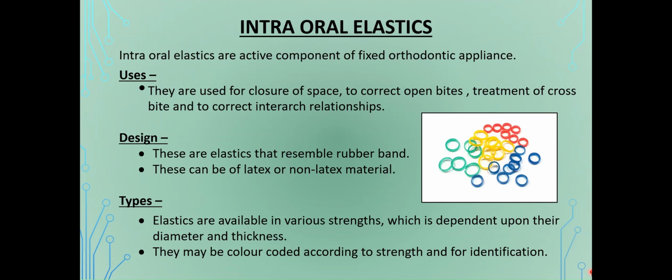Design: these are elastics that resemble rubber band. They can be of latex or non latex material. Types: elastics are available in various strengths, which is dependent upon their diameter and thickness, and are also color coded according to strength for ease of identification.